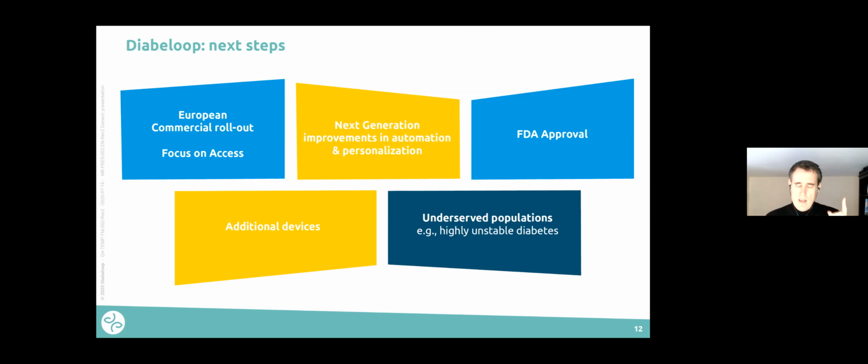Now, with one caveat, the DIY community oftentimes is not representative of the people living with type 1 at large. Okay, so you've got to take that small caveat. But with that caveat in mind, you can still get what's needed. So for example, how do you design a system where adolescents can go to school with an automated system and the acceptance of that? So we're running a clinical trial soon where we've tried to think of a system where you don't need meal announcements, you don't need to bolus. The system runs automatically if you want to.